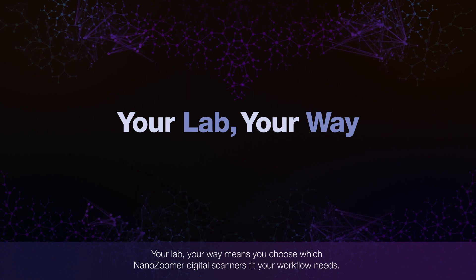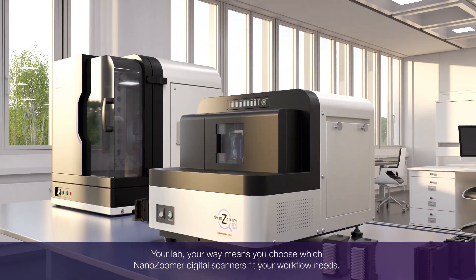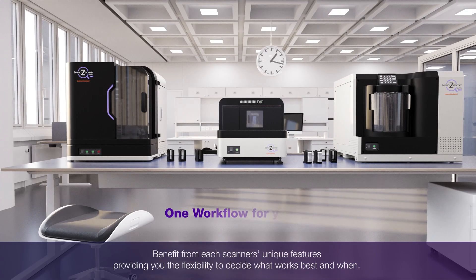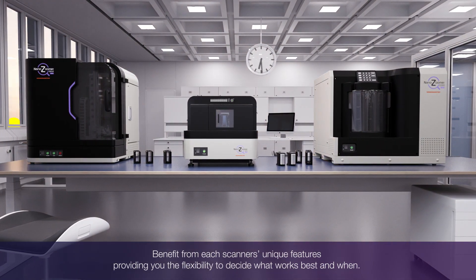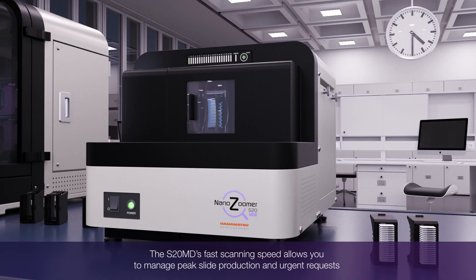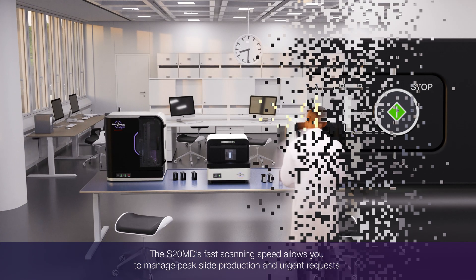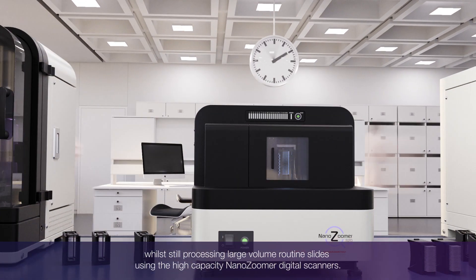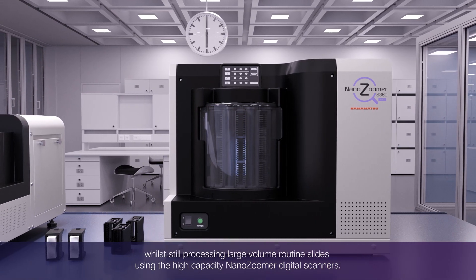Your lab, your way — you choose which NanoZoomer digital scanners your workflow needs. Benefit from each scanner's unique features, providing you the flexibility to decide what works best and when. The S20's fast scanning speed allows you to manage peak slide production and urgent requests, while still processing large volume routine slides using the high capacity NanoZoomer digital scanners.